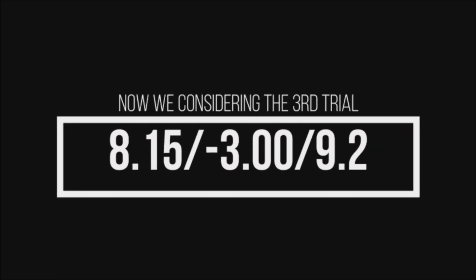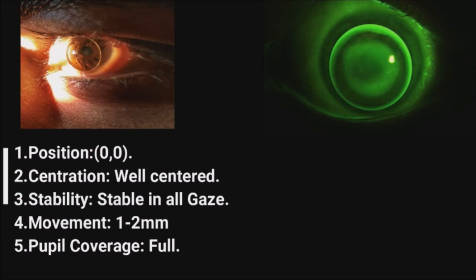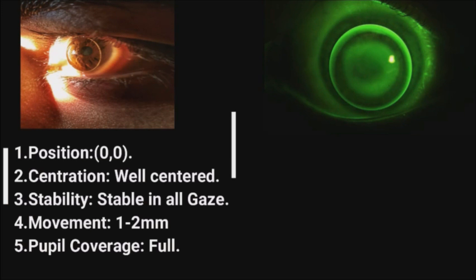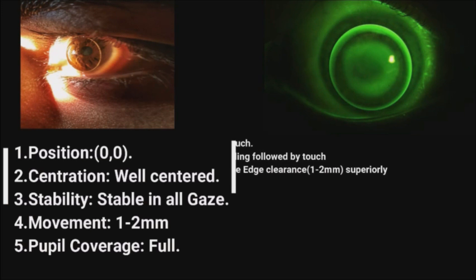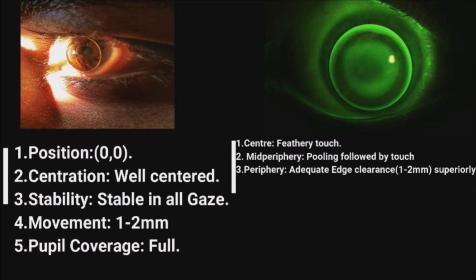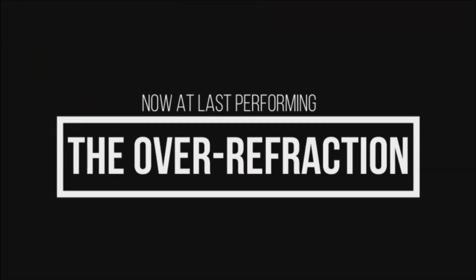In the third trial dynamic fit, position is 0-0, lens is well centered and stable in all gazes, movement is 1–2 mm, and there is full pupil coverage. In the static fit, there is feathery touch in the center, pooling followed by touch in the mid periphery, and there is adequate edge clearance of 1–2 mm superiorly. Hence the fit is considered as ideal.